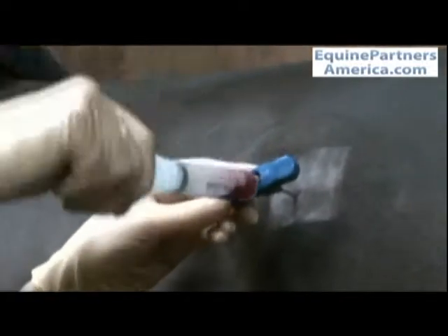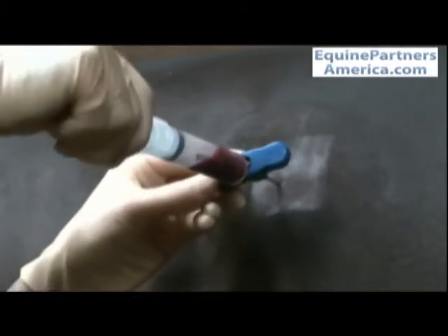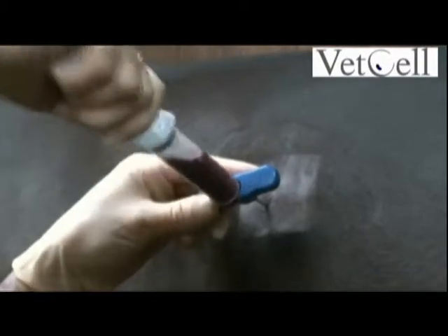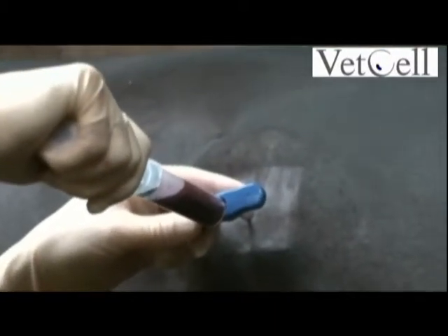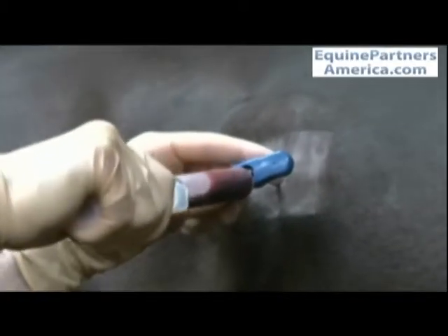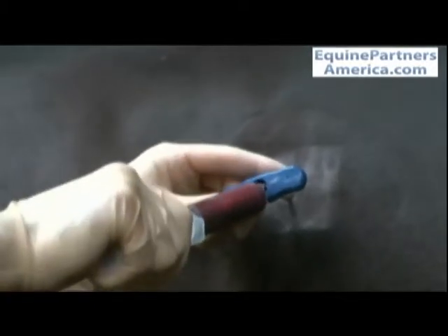I try and mix while we're doing this because that heparin is toxic to the cells. So if you can encourage it to mix, that'll hopefully preserve them a bit better because they are really fragile. And that's plenty.